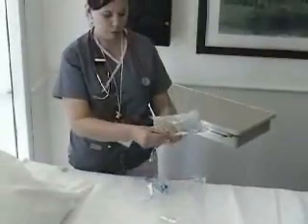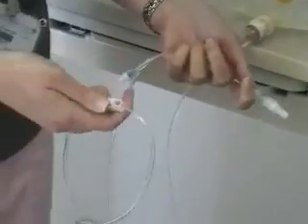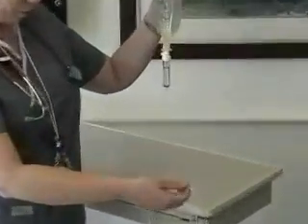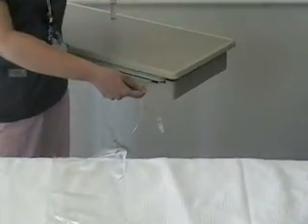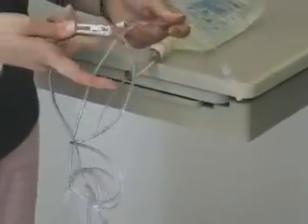Then take the end of my tubing right here and I hold it over a trash can and I just roll open the clamp. When I roll it open, I'm going to see my solution running through. You want to do that until you get all the air out of the line. Now we're dripping into the trash can and I don't see any air left.